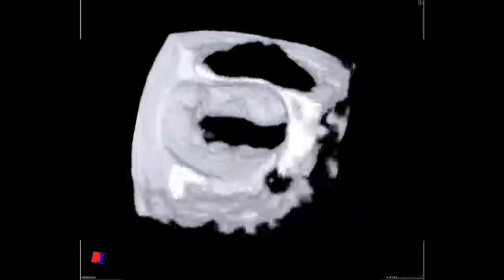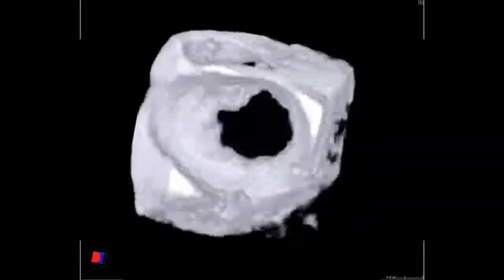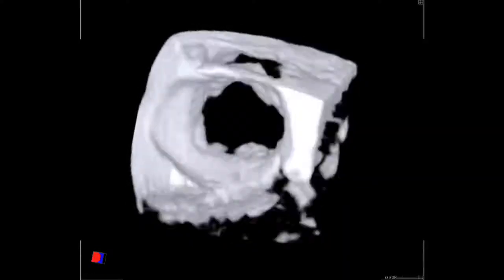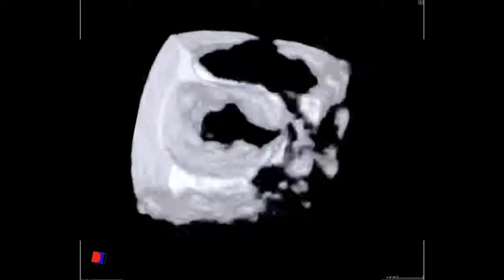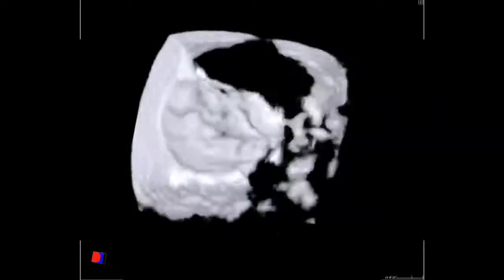In this image, you can see the reconstruction, a three-dimensional echo of the mitral valve apparatus. This is the anterior leaflet of the mitral valve in the top position and the posterior leaflet of the valve in the lower position. One can even see the individual scallops, and if you'll notice, in the 10 o'clock position of the mitral valve, there's a bulge or a mass.